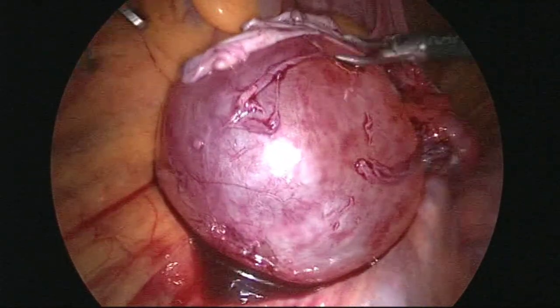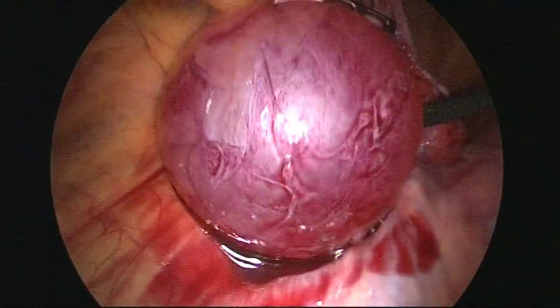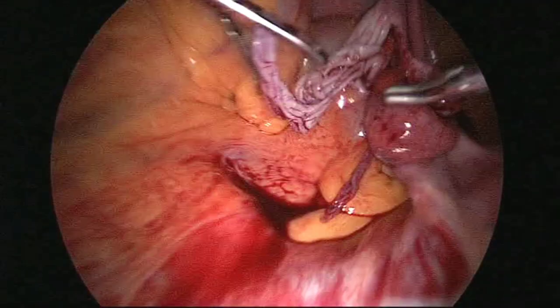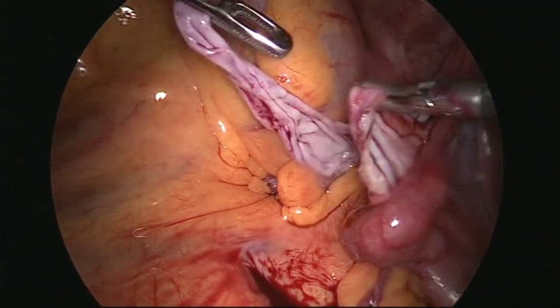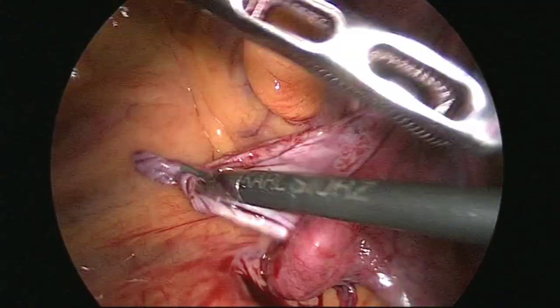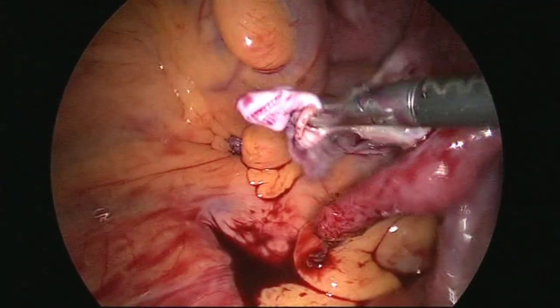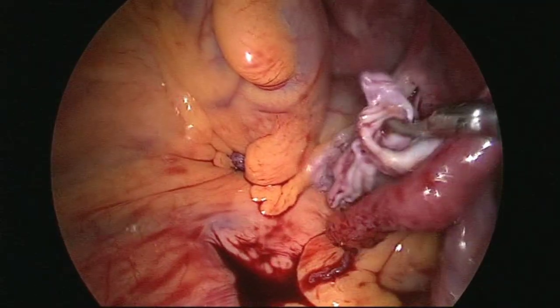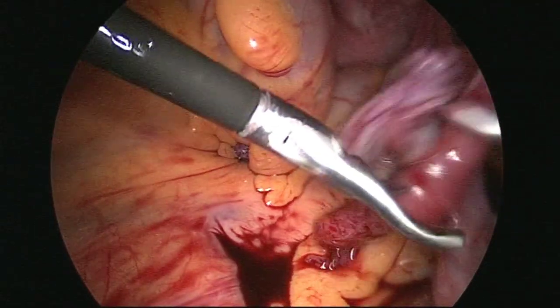Completely intact, there is no rupture at all, not even minimal rupture, like a small football. This is the surgery site. I'll check for any active bleeder, and you can see the tube I didn't touch in my surgery, looking unhealthy.